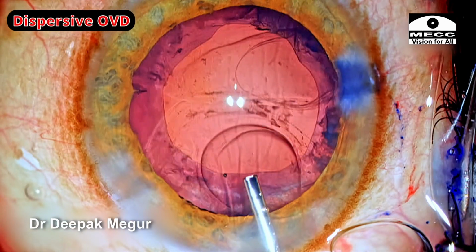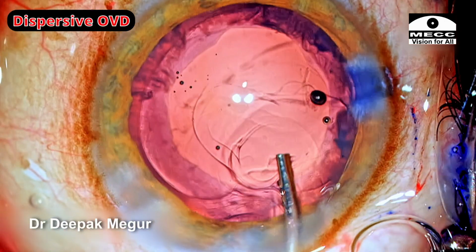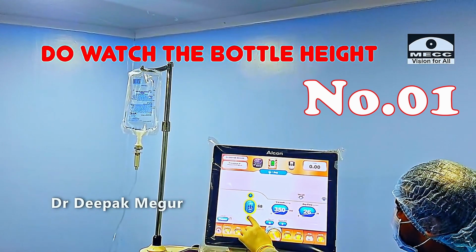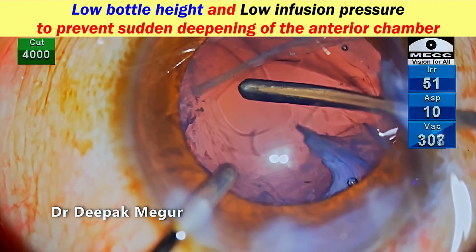The standardized protocol is to inject dispersive OVD after recognition of a PC tear. Then, the most important thing to do is to lower the bottle height as the infusion cannula is being introduced into the antechamber. This will ensure that there is no sudden deepening of the antechamber.